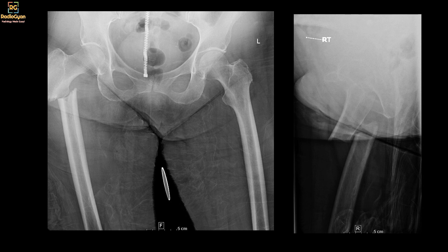Investigating further, this patient had been on bisphosphonates for more than five years. And this is a common presentation of one of the complications of bisphosphonate therapy — that is atypical femoral fractures.